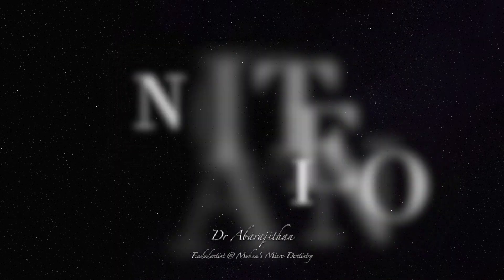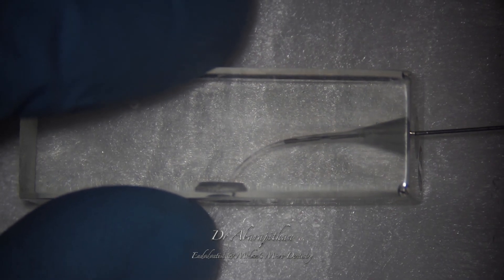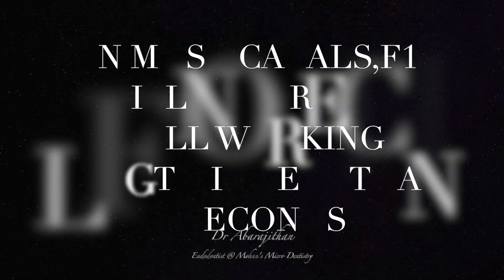One can appreciate the importance of surfactant in sodium hypochlorite. We will be placing the needle just at the middle third, but the surfactant reduces the surface tension of the liquid and you can see that the fluid flows freely to the apical third. So it improves the wettability.